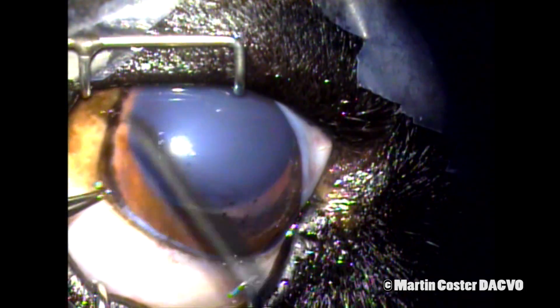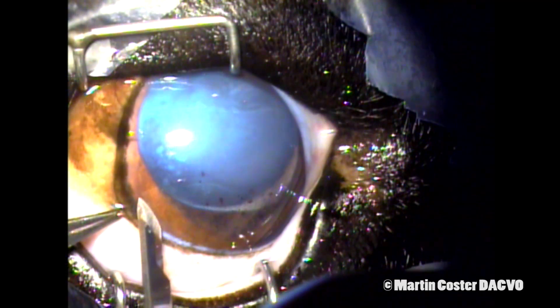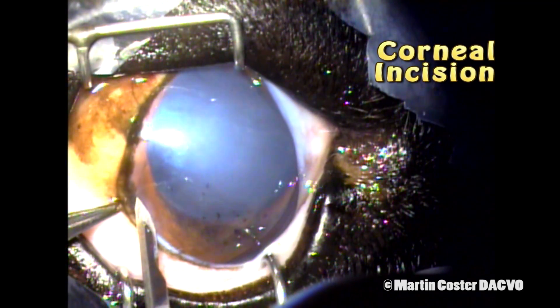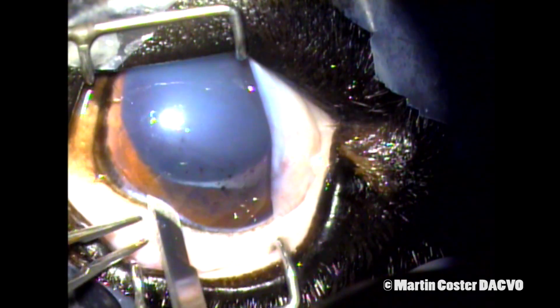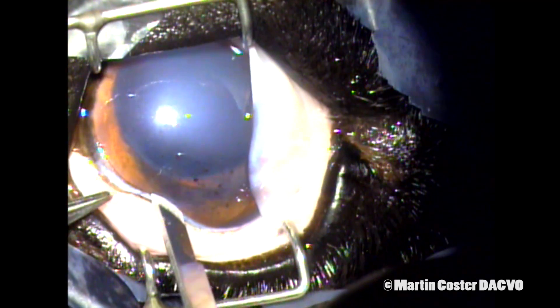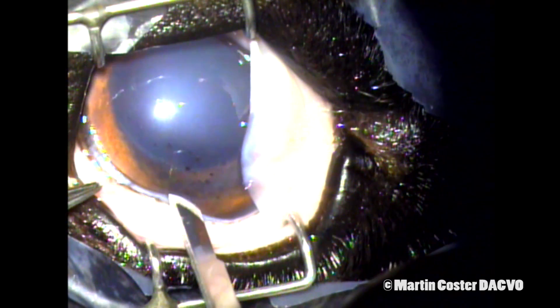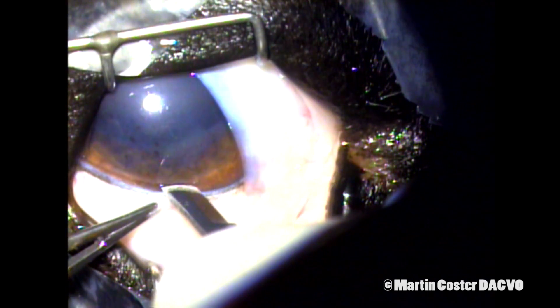We begin the surgery with a partial thickness corneal incision using this beaver blade. The incision spans anywhere from 120 to 180 degrees around the superior aspect of the cornea, depending on patient size and lens size. The incision depth is about three quarters into the cornea and we go in one continuous motion around the cornea.